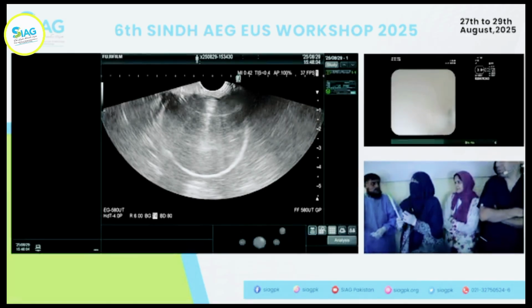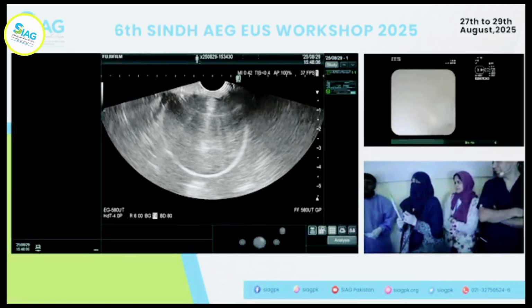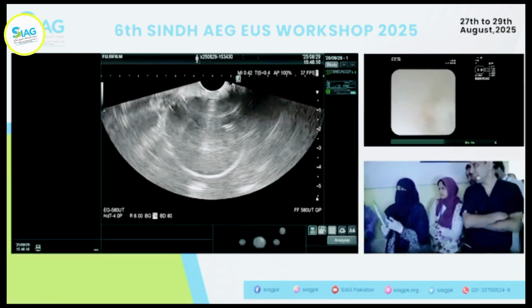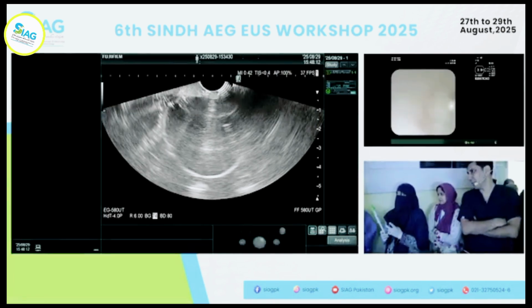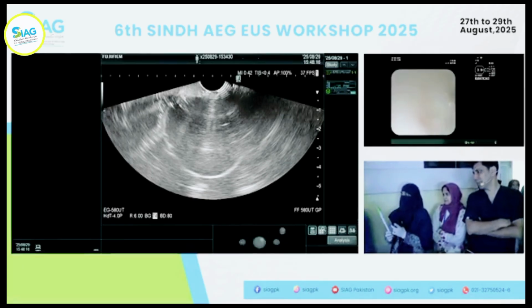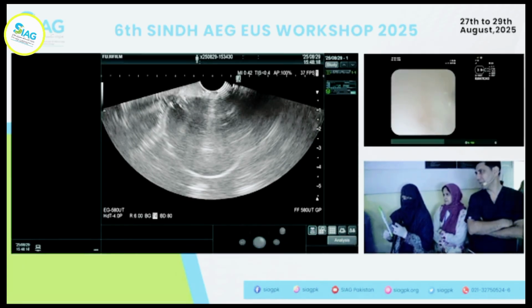Maximum 10-12 minutes. We just get one. So tip up. You're losing your views. Air coming in. Improve coupling. I know it's a model, but you still have to make an effort. Yeah, it still works. Yes. You know, a little bit of air. Tip up would work.